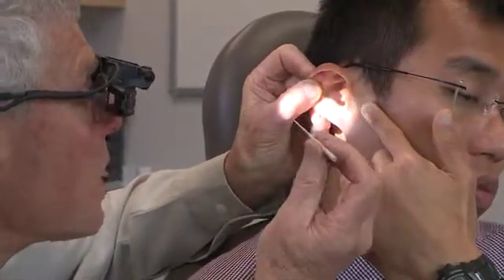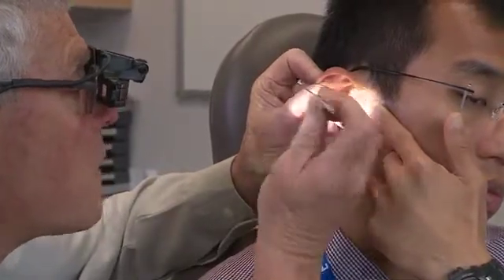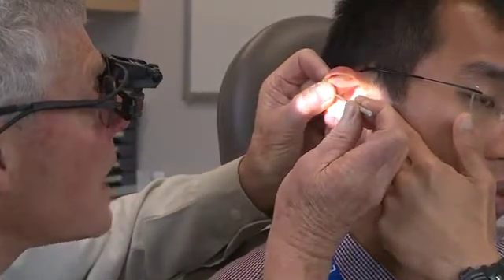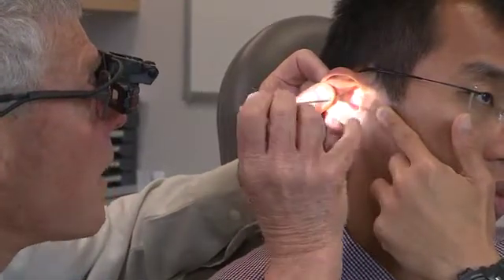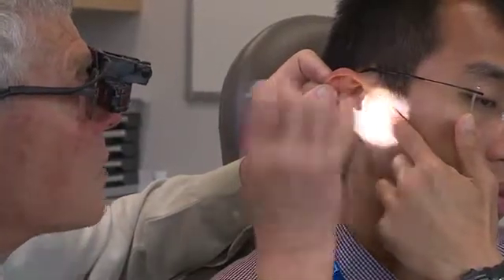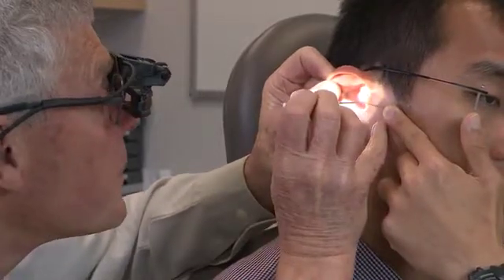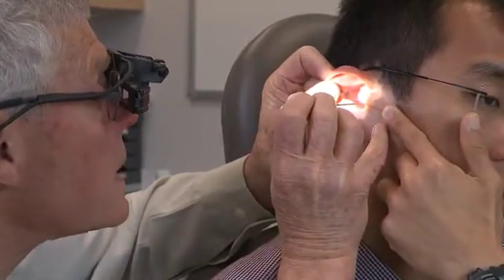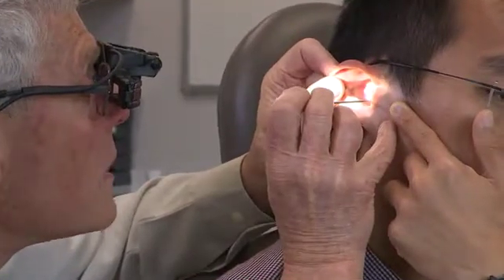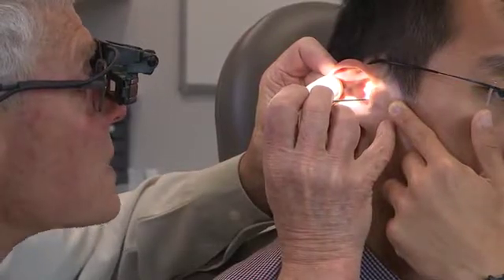The other thing is you've got to be safe. If something happens and the head moves, you're safe if you've got a prop. Your fifth finger needs to rest there. Now it's a bit awkward getting it into the ear if you're just going like that and everything's wobbling around. The trick is to rotate your hand that way, put your finger down and then rotate it in. And the other trick is to slide it along the tragus here, so that you're not having to have wonderfully steady hands.